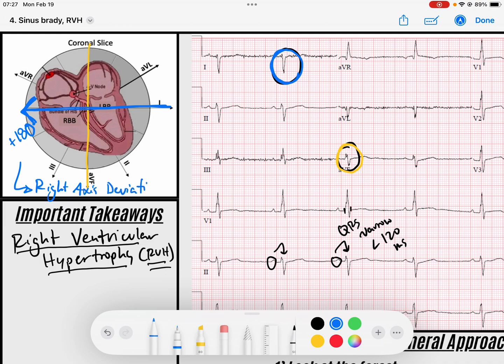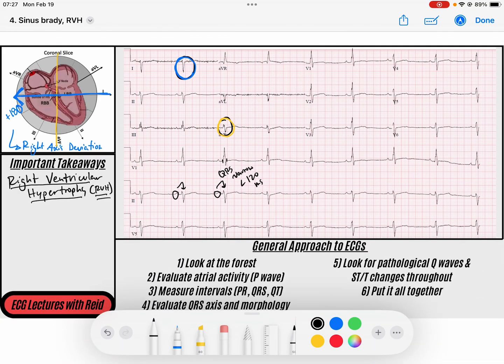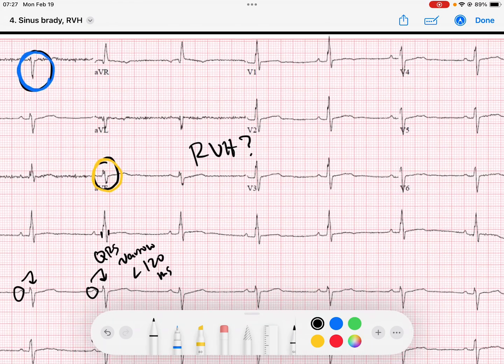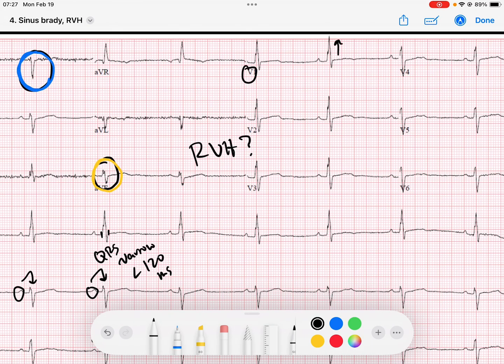We see right axis deviation and we think, what could cause this right axis deviation? The first thing that should come to your mind is, does this person have right ventricular hypertrophy? This is in the setting of our sinus rhythm, so we know the AV node is conducting the signal down. I look into V1 and I see these dominant R waves. That's not typical of V1.